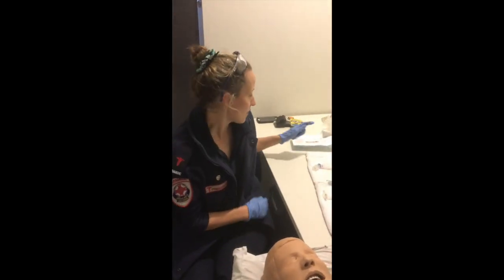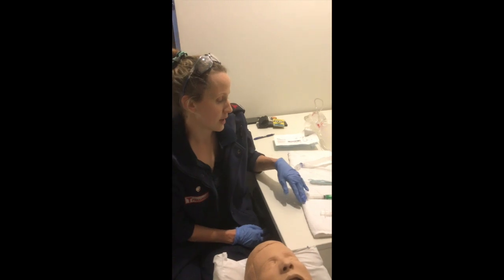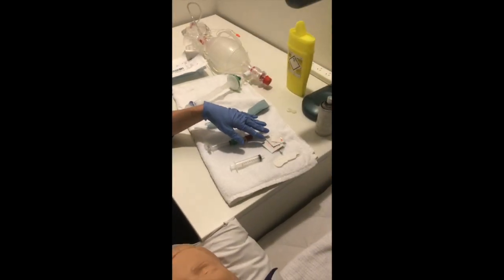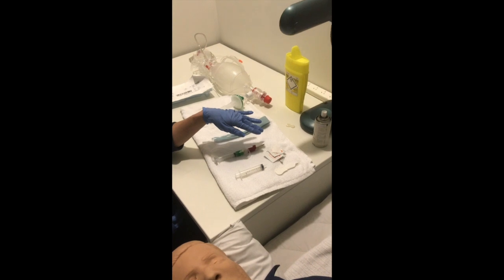So we have our equipment placed out here. In Victoria we use a Quick Track 2 device. We have our swabs prepared. In the setting of this being an emergency procedure, the idea is to aim for clean as opposed to an aseptic technique. So ideally you would still attempt a swab.